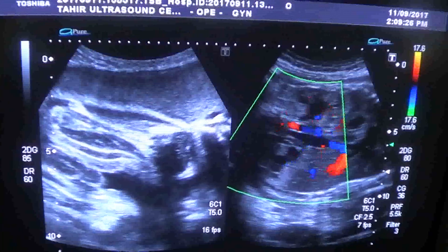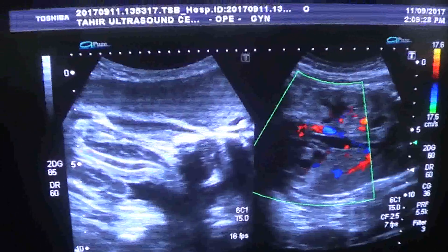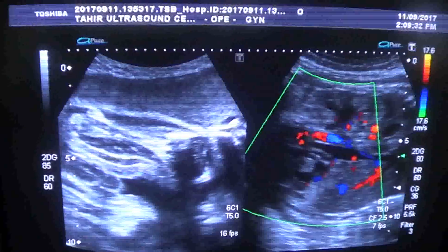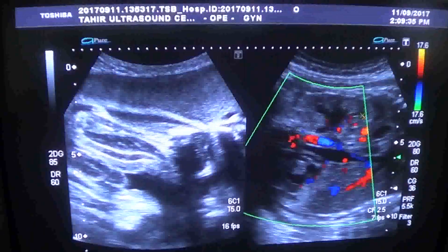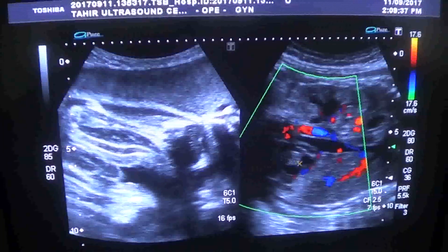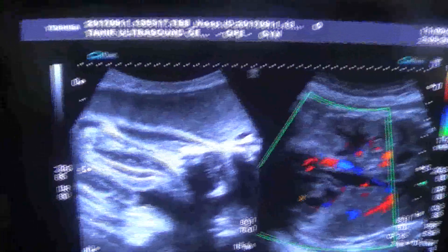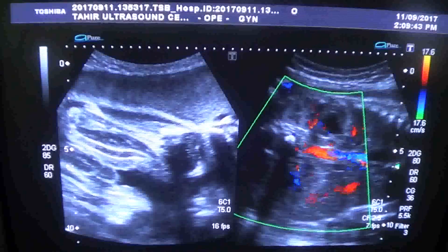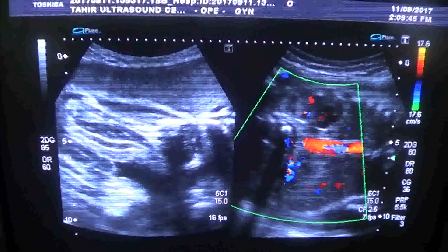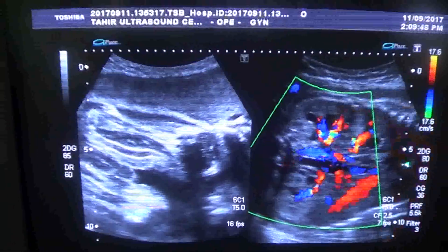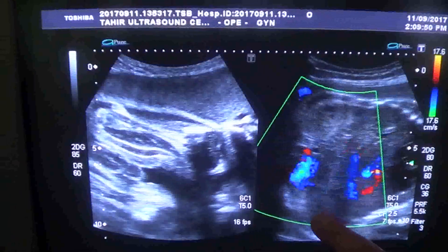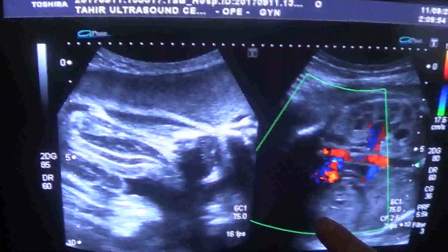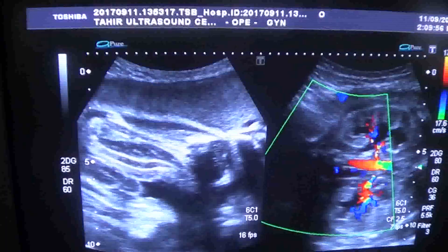We are now seeing both kidneys. This is the right kidney and this is the left kidney. You can see the aorta between the two kidneys. Both are showing an equal degree of pelvicaliectasia.